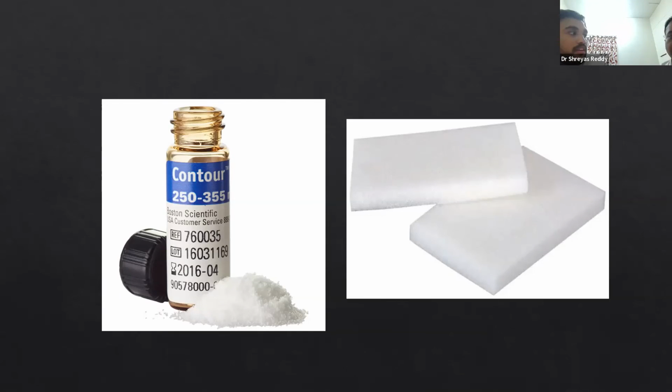Yeah. So we have already discussed that the PVA particle is a permanent embolic agent, and gel foam is a temporary agent. So what is this 250, 355 written over here? That is the size of the PVA particle. Yeah. So these are generally polyvinyl alcohol particles which are pounded and powdered and pass through separate sieves having holes of these micrometer sizes.